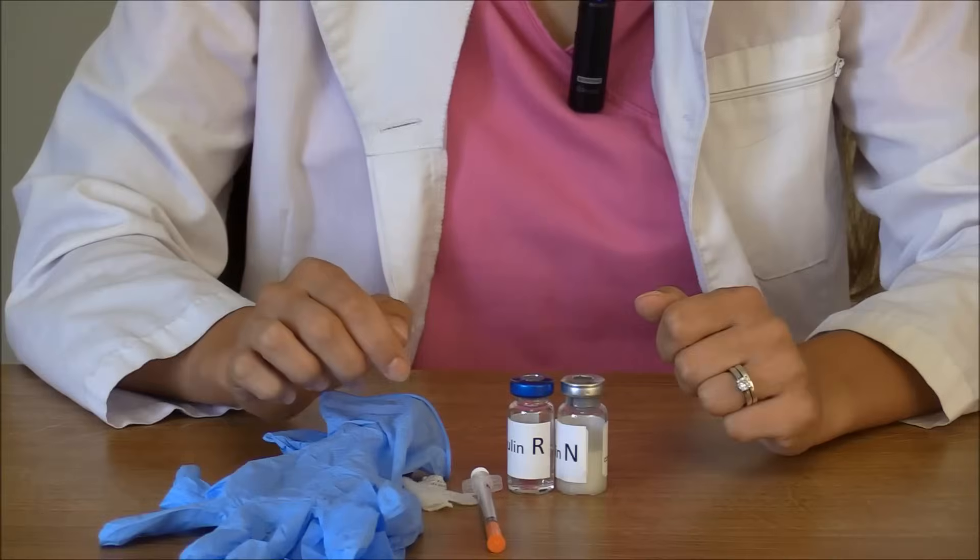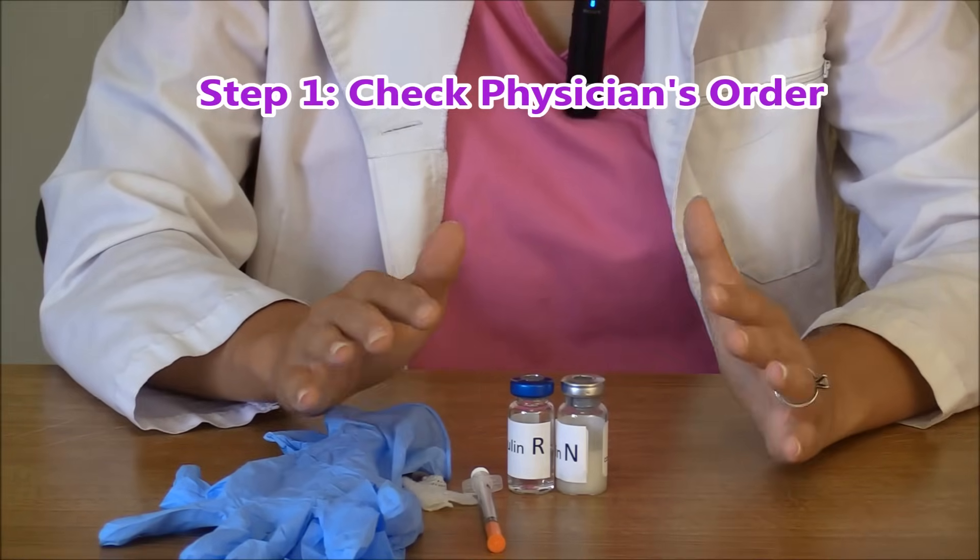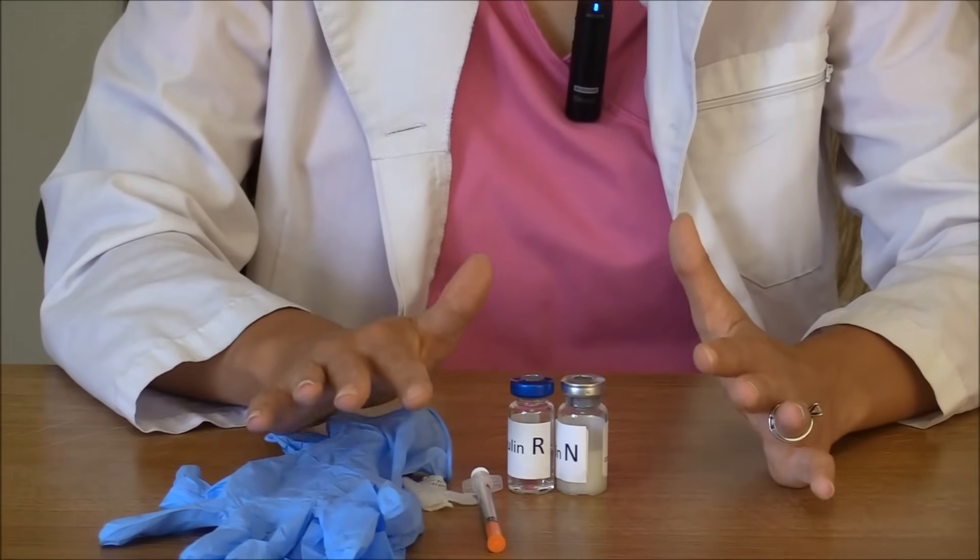Now I'm going to show you how to actually mix insulin. This is just an example — always follow your hospital protocols and your doctor's orders, because procedures and medications do change over time. The very first thing you want to do is check your physician's order to confirm how much insulin you're actually giving.